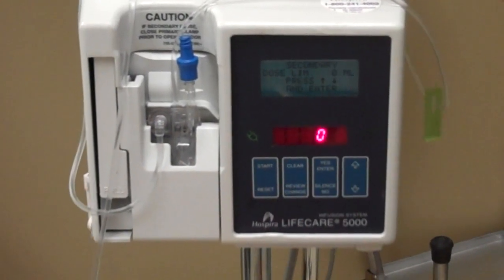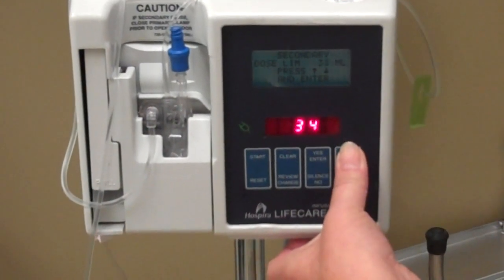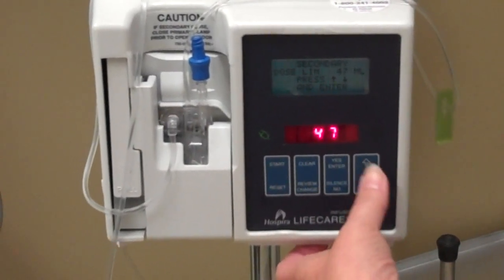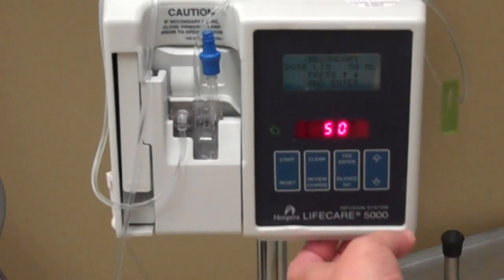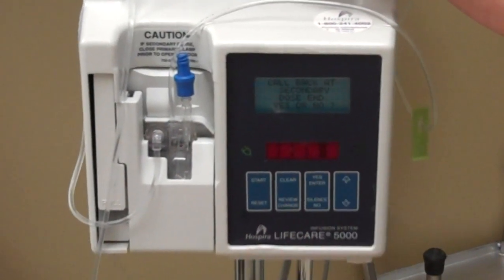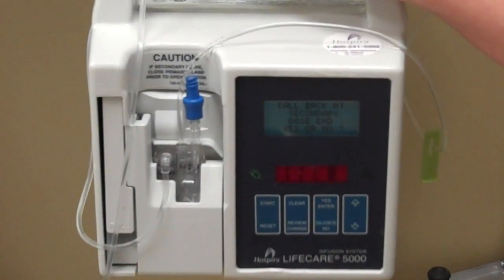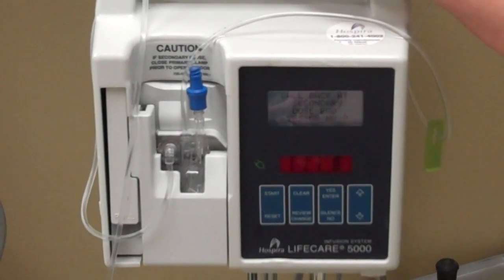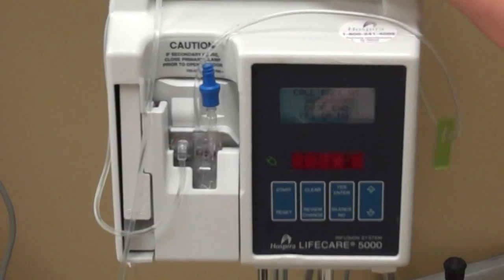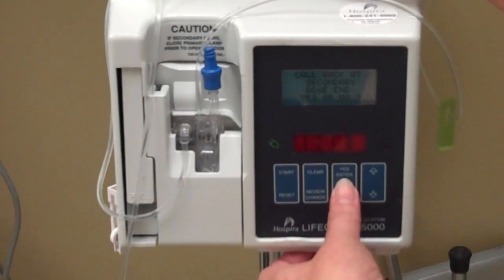Secondary dose limit means how much is in the bag, and there's 50 mLs in the bag. You will see some nurses set it for 45 because they don't want air in the line, but usually for an antibiotic the pump beeps if air gets in the cartridge, so I'd rather the patient gets all of their medicine — I usually set it for 50. Enter. Call back at secondary dose means do you want it to beep when the secondary is finished? If you're on a hallway with nine patients, you may not want your pump beeping unnecessarily. So no, you don't need to let me know when it's done.